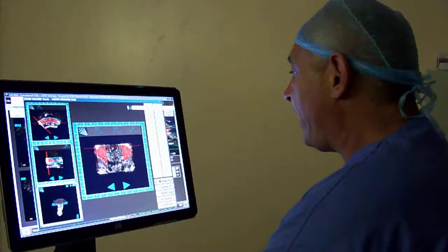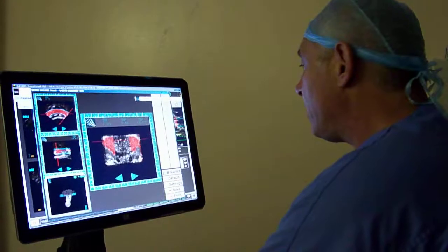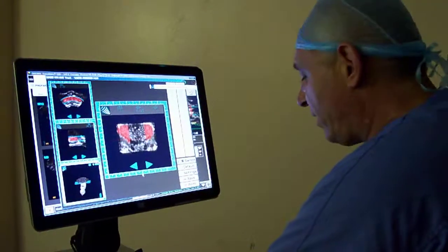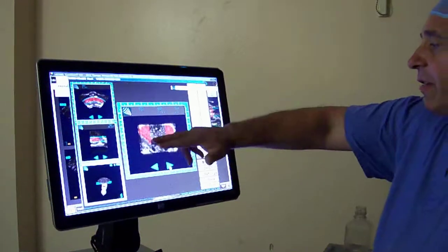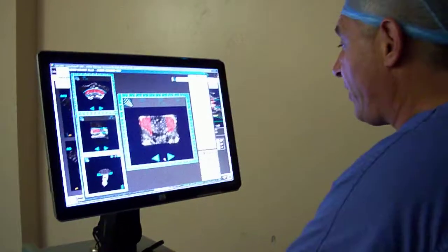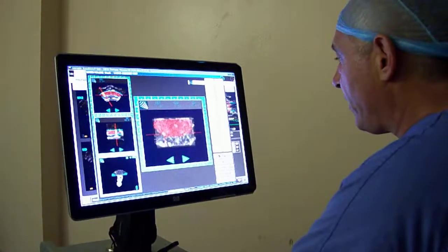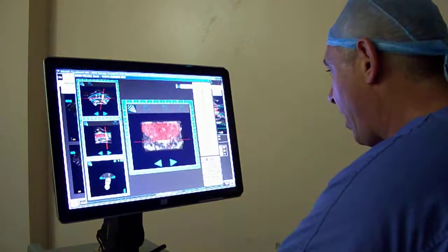It's kind of like an Etch A Sketch, and I'm painting in exactly where I want to put energy, and conversely I'm taking away areas where I don't want to have energy, okay? And by looking at the different levels, you can see the subtle whiteness there. There it is right there. See? There's the plane. So you can get a sense that maybe the apex even comes out this far.